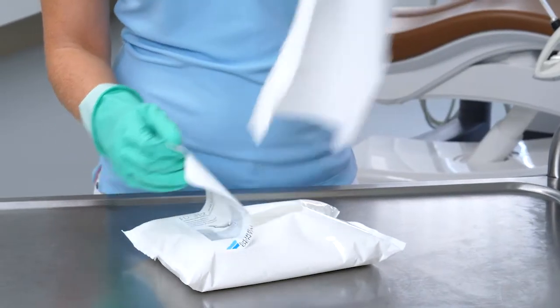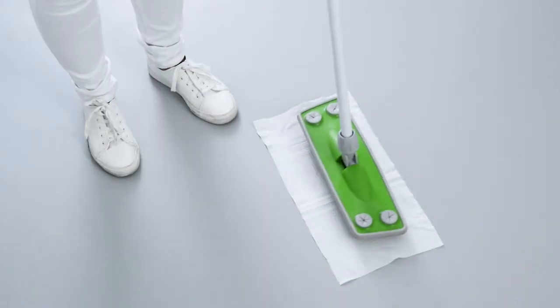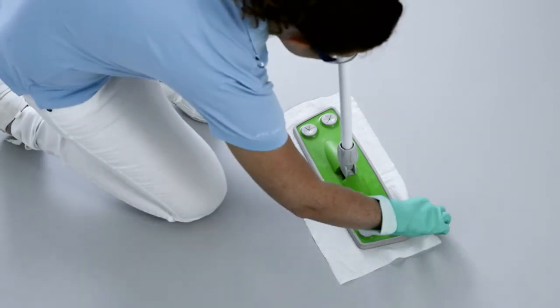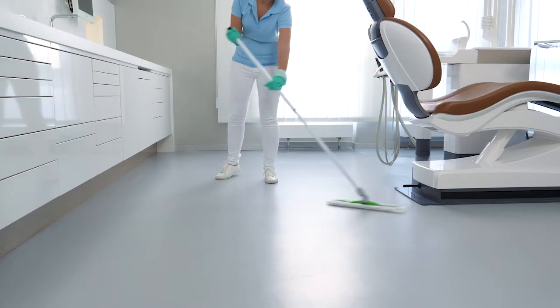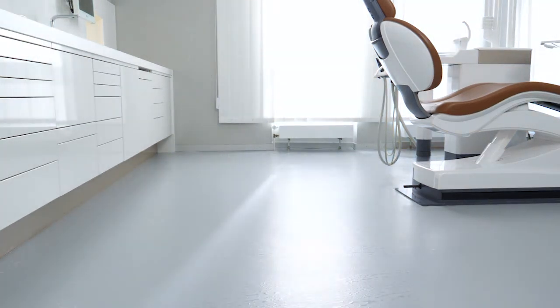Alternatively, you can also perform the two-cover method using disposable disinfection wipes, e.g. with FD312 wet wipes from DÜRR Dental, which you dispose of after use. After all routine surface disinfection measures have been performed, the surface can be used again as soon as it is dry.